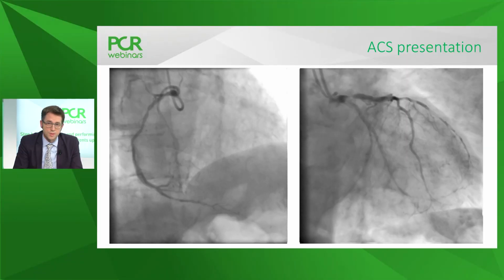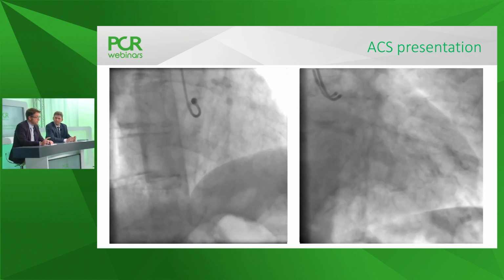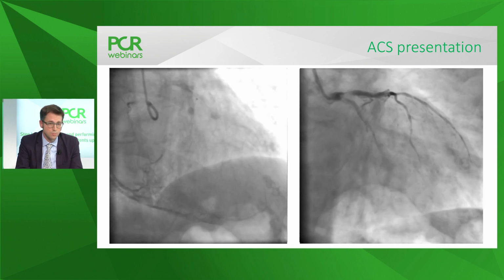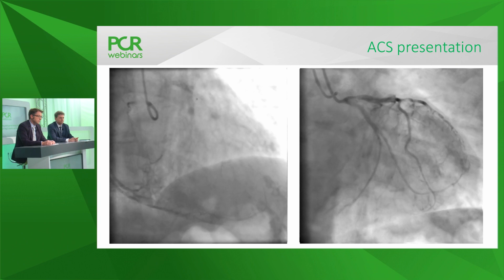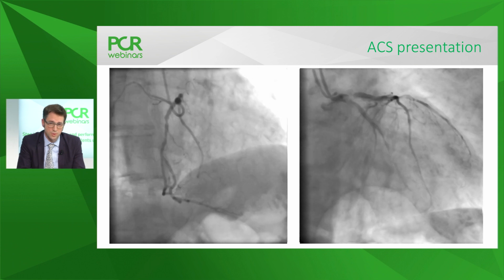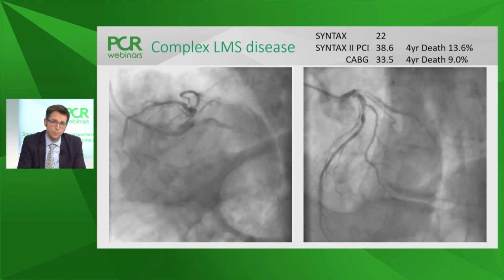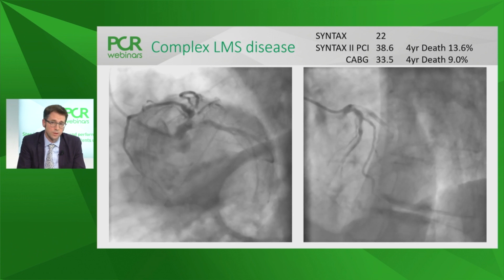So he comes to our cath lab, and here we have images of the right and left coronary systems. We have evidence of a kind of codominant system with some backfilling from the distal right coronary to the circumflex territory. And on the left shots, a really very complex distal left main, but predominantly proximal LAD, proximal circumflex disease. So we see some backfilling there into the circumflex territory. And here in this PA caudal view, we see evidence of really very clear-cut severe disease at the ostium into the proximal LAD, and additional disease with TIMI 2 flow in the circumflex. And importantly, if we then come down to this spider projection, we have evidence of very high-grade disease, but superimposed upon that a very significant bulk of calcification.